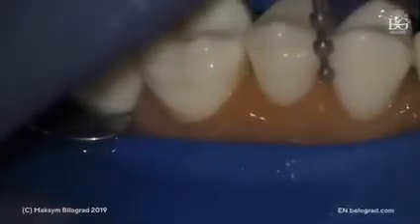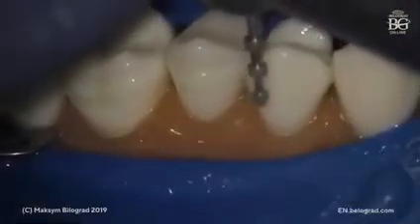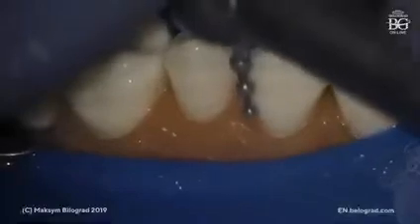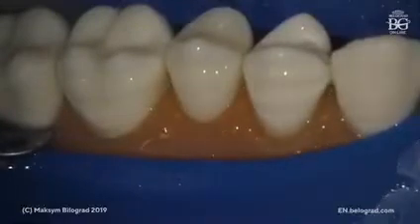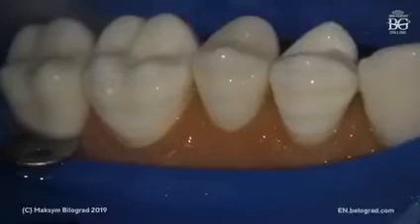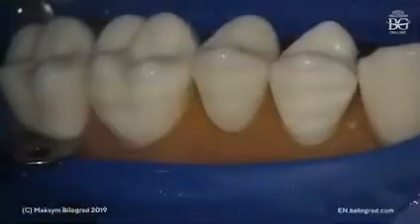This premolar will be prepared. This part we will do prep, and also supra, it has to be done supra-gingival. Okay, this is important. What else? The molar tooth will be prepped for window prep. I will explain why and in which kind of cases, what is the indication.